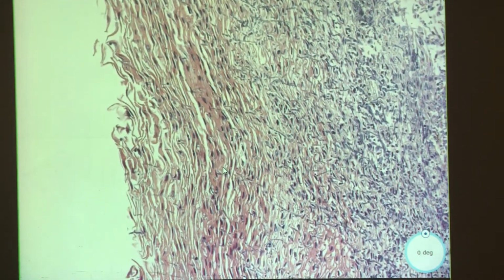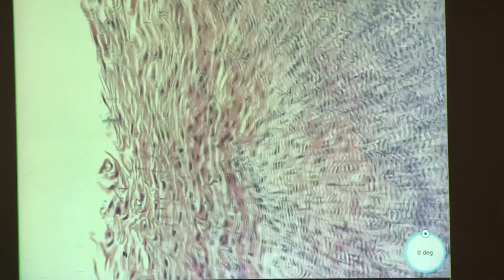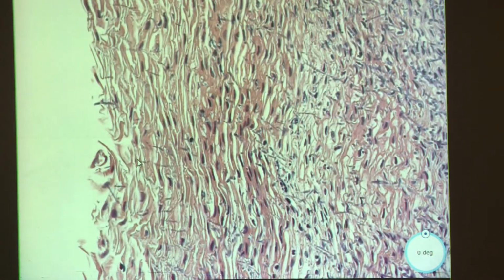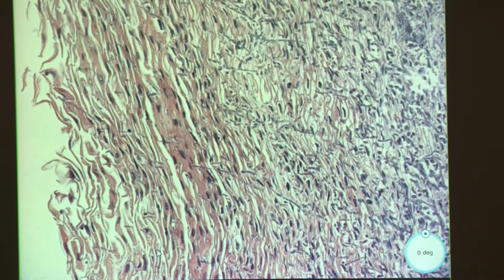So I would say if it's positive, it's probably Candida. Kind of has that look to it. It's a bit of a pseudohyphae type thing. Through the projector, it almost looks like they're ghosting over top. I think it's a little easier to see on your computer screen. But yeah, this is Candida, just florid.